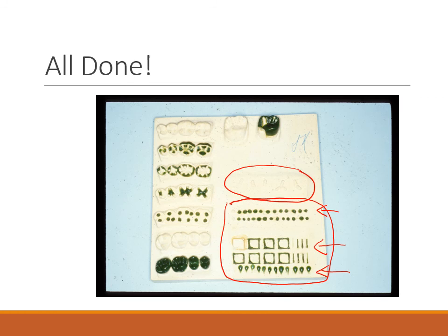When you're ready to start the left column, you're actually going to start from the 3rd to last row. So this is the starting point. Here you're going to be waxing all of the main cusp cones, which are the highest points of the tooth, using the example below. So you're going to look at this in order to wax that. After all of those cusp cones are waxed, then you can move to the next structure above. So you're going to start from the 3rd, and then you're going to move up with each step.